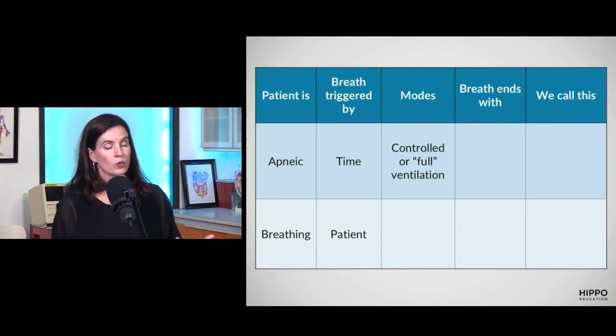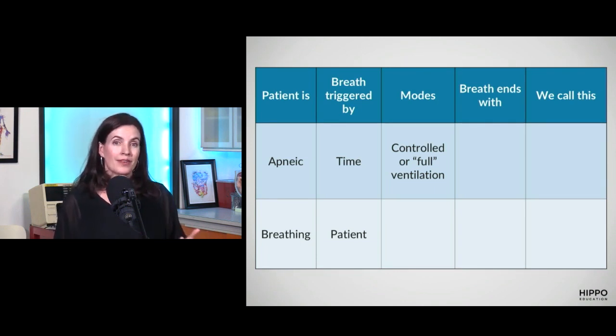Are they on a controlled mode of ventilation? Or maybe they're even asking, is the patient apneic? And that's what they want to know. In contrast, when your patient is breathing, we call this spontaneous modes of ventilation or sometimes support modes of ventilation. So if we understand how the breaths are triggered, we then need to tell the machine when to stop blowing the air in. It needs to have a limit for when it stops.